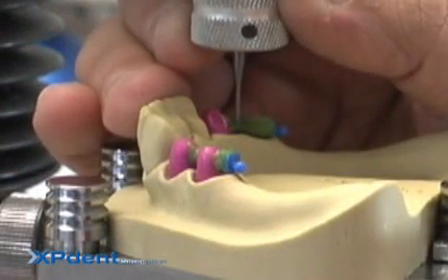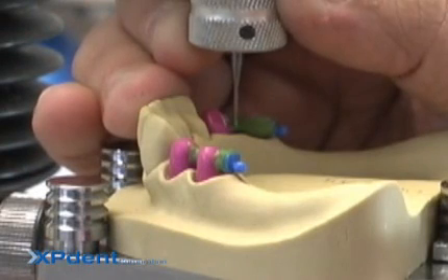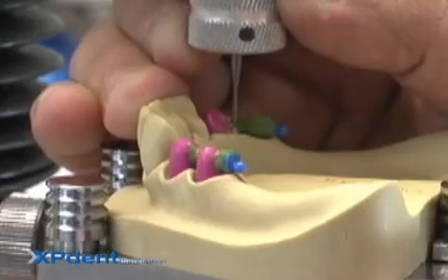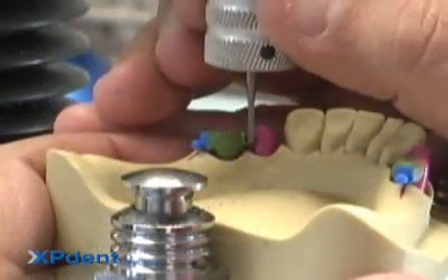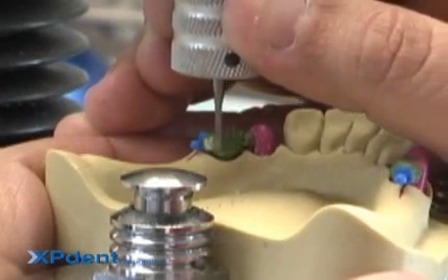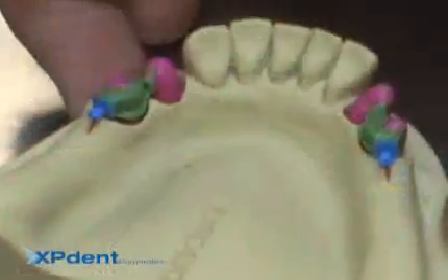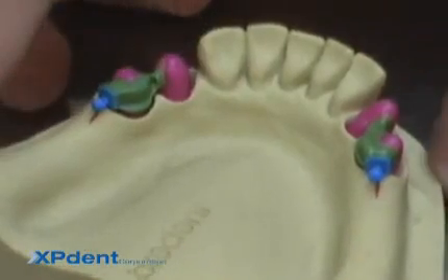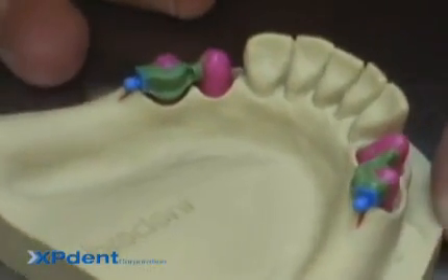The SG-SV Patrix has a very small height profile, allowing it to be used in a wide range of cases.